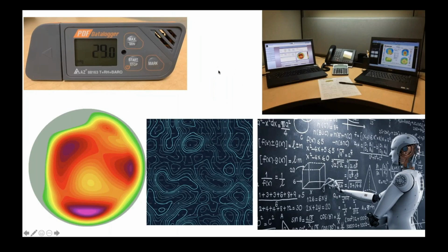Also, some other things are, this device here measures temperature, humidity, and atmospheric pressure. It measures it continually, every single day. Once a week or once a month, you can take off this cover, attach it to the drive on the computer that runs Phorcides. Phorcides will pull all of this information up into your cloud. We all look at temperature and humidity each day as we sit down and do LASIK. We want to make sure they're within the norms, but nobody really writes that down and then looks at what effect that has on your nomogram. Phorcides is going to do this for you.